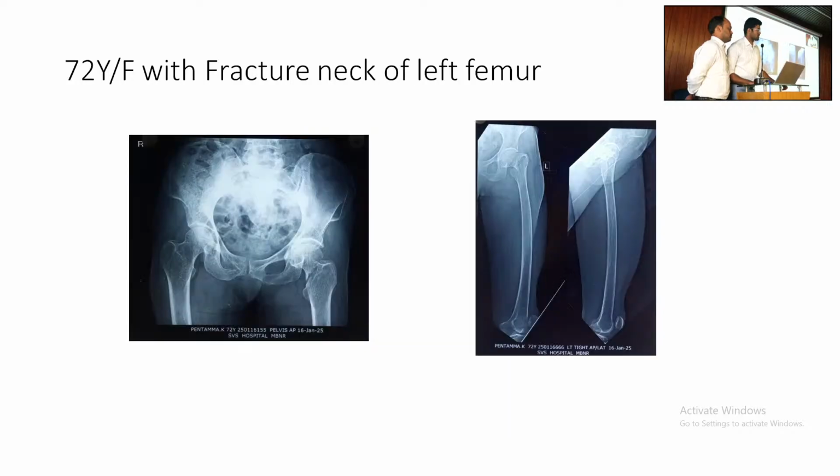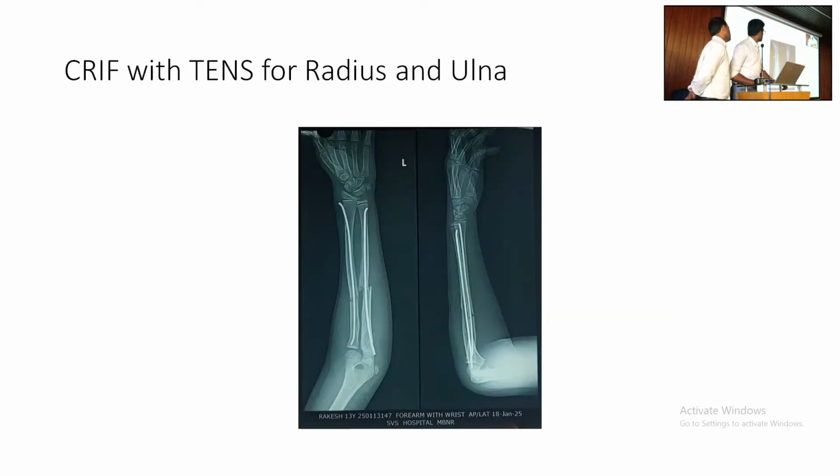Do you have any entry point for this? Sir, where is the entry point for this? Very near to the physis or not? Away from that, sir. How much? It was 2 centimeters around. 2 centimeters. Yes, sir. Good.